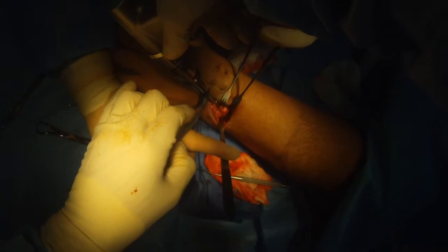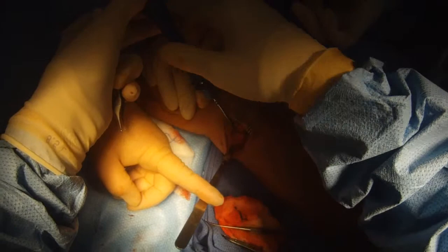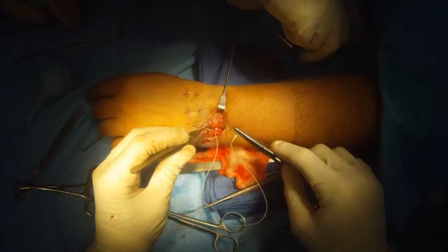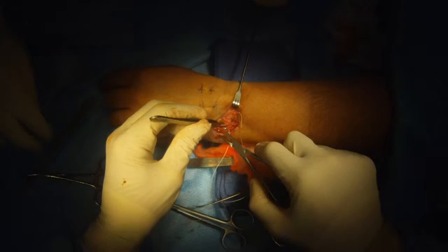Now we'll drill the hole for the second screw over the second guide wire. You can see on the x-ray that the ulnar bone is on the right, there are two screws there and it's all closed down. The bone has been shortened and everything looks really good. Now we close up the wrist.